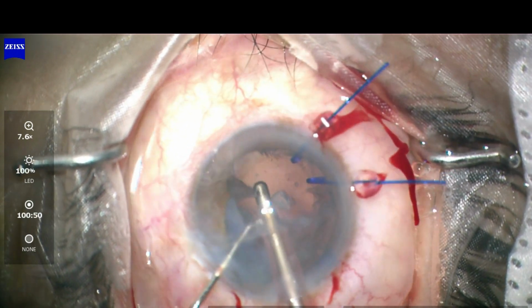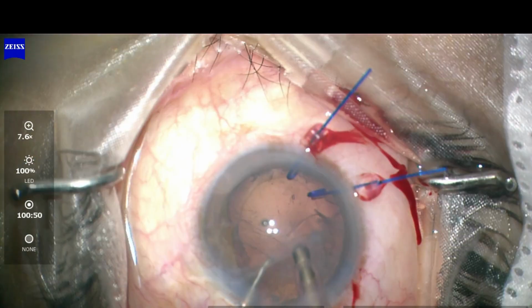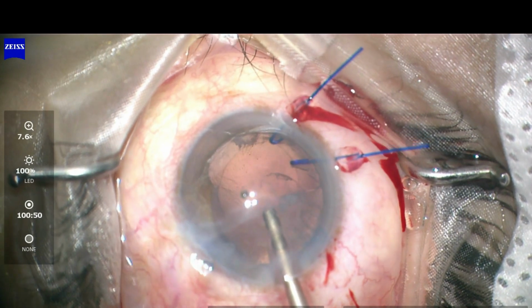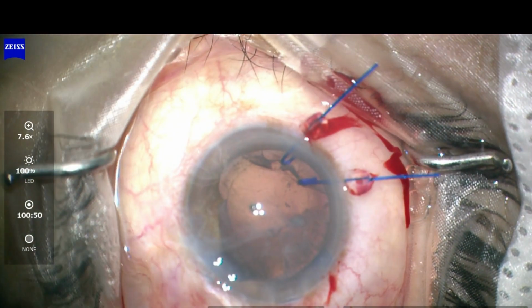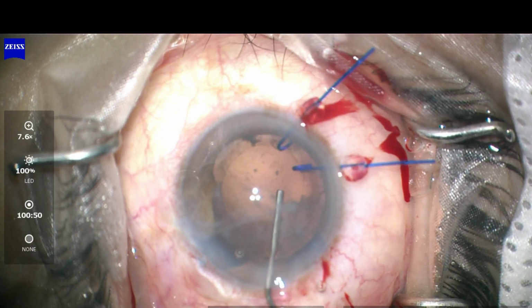Next step is to remove the cortical matter. First, remove the cortical matter from other areas and then finally in the area of subluxation. Here again, before removing the irrigation aspiration probe, inject viscoelastic into the anterior chamber and form it.